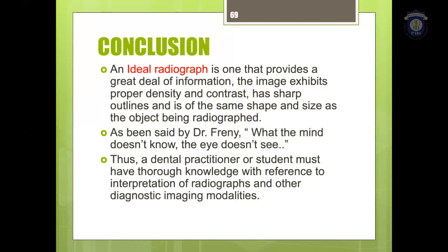So to conclude, an ideal radiograph is one that provides a great deal of information. The image exhibits proper density and contrast, has sharp outlines and is of the same shape and size as the object being radiographed. As has been said by Dr. Freni, what the mind doesn't know, the eye doesn't see. Thus, a dental practitioner or student must have a thorough knowledge with reference to interpretation of radiographs and other diagnostic imaging modalities.